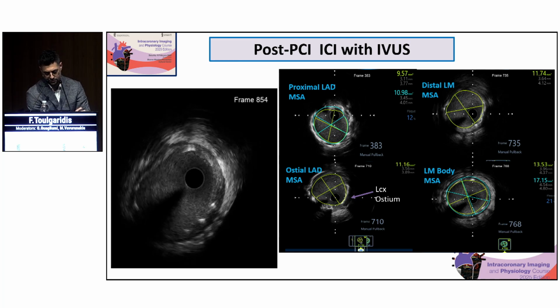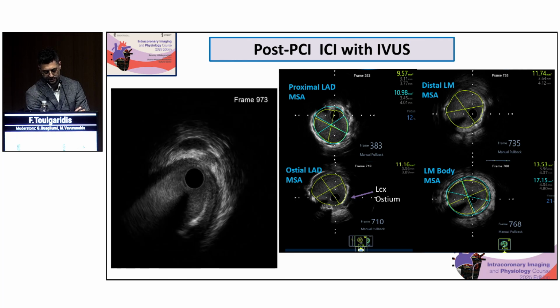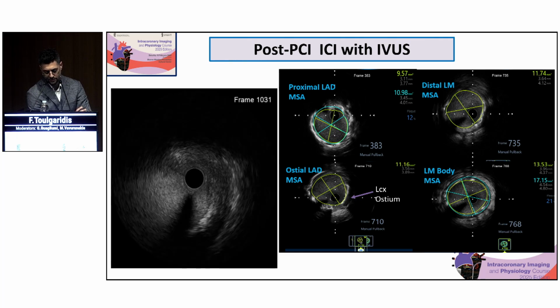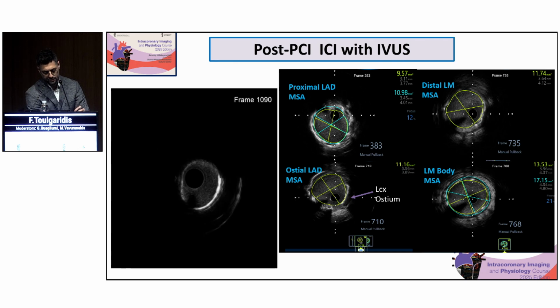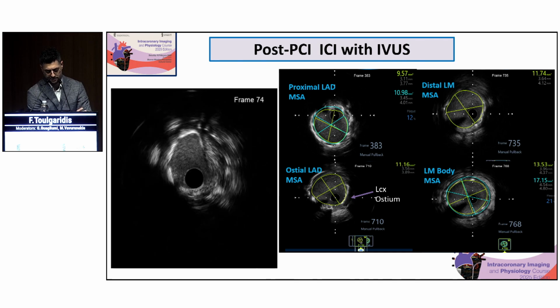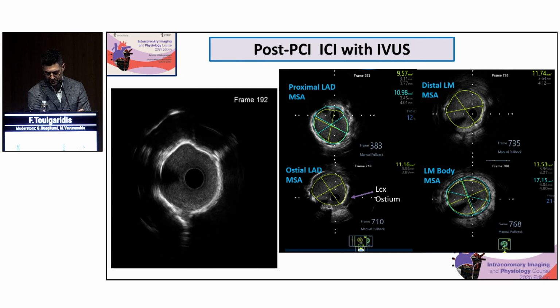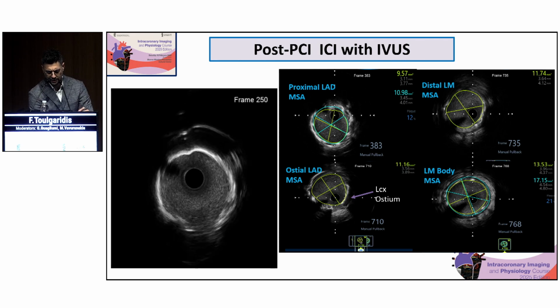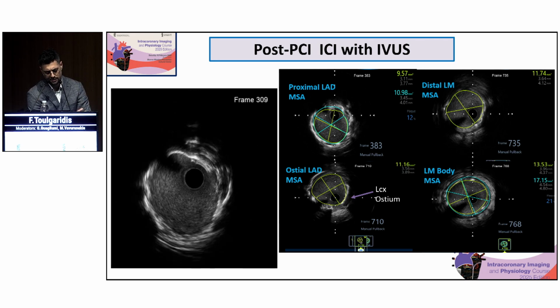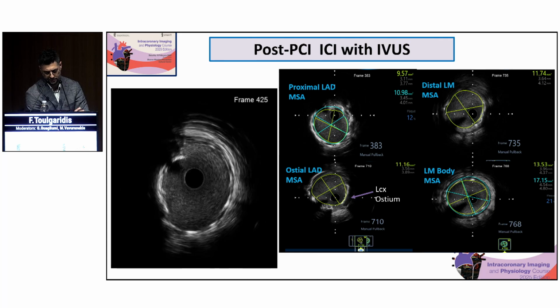We were happy to see that at least at almost every part, the stents of the new DES were nicely apposed to the wall with good expansion and no major mechanical issues like, say, a large dissection, etc. And all MSA measurements were within accepted values. So we were happy with the result. And afterwards, we always take it with angiography, but this is the imaging part.